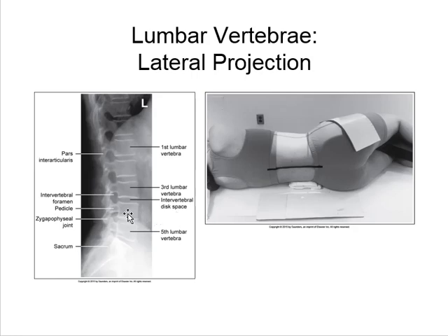All right, so toilet tissue is a big thing right now. If you were to take the roller out of the middle of a roll of toilet tissue and look at it straight from the side, on a two-dimensional scale it would look boxy in appearance. But if you tilted it toward or away from your eyesight, you would start to see down the center of the tube. And that's what you're going to see if you don't put the spine parallel to the image receptor. You're going to start to see the top and the bottom of the vertebra, and they look more like a drawn tube.